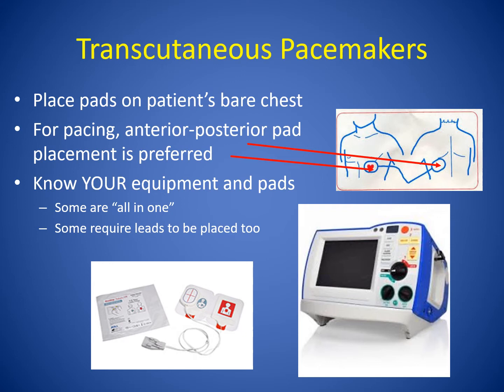Usually you would put those pacer pads on anteriorly and posteriorly. That is the preferred method. And looking at the pictures of your pads, again, know the pads that you have in your facility and make sure that you know how placement should be done.